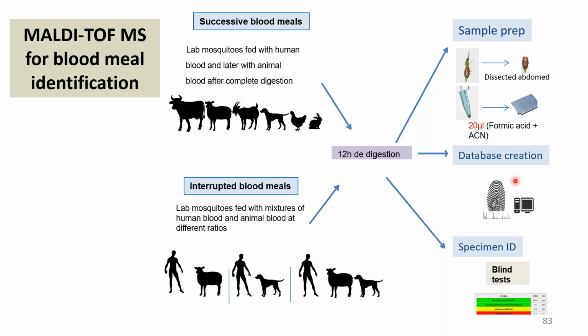But the other mosquito was Aedes albopictus, which was really different from our database that was built on Anopheles gambiae, so its blood meal couldn't be identified. So we had to create an additional database for Aedes albopictus. But it's okay, because it's so easy to share spectra by email or supplementary data. And also if it works within a species complex, it helps you a lot.